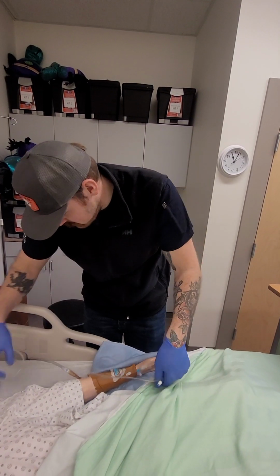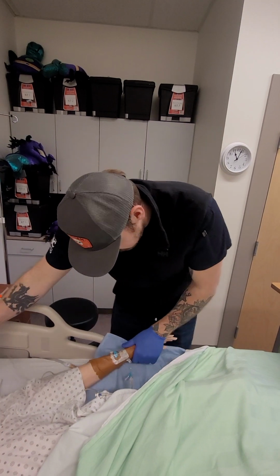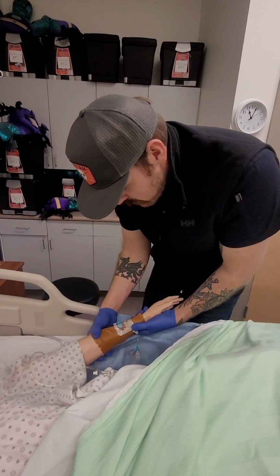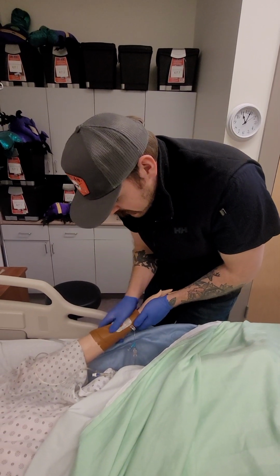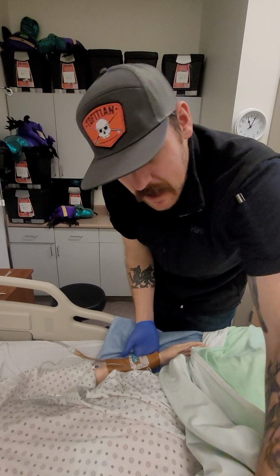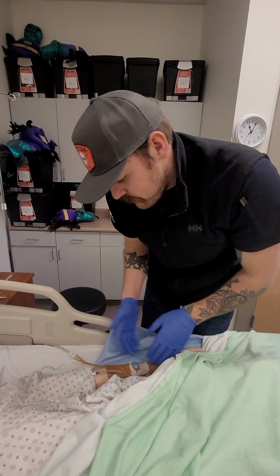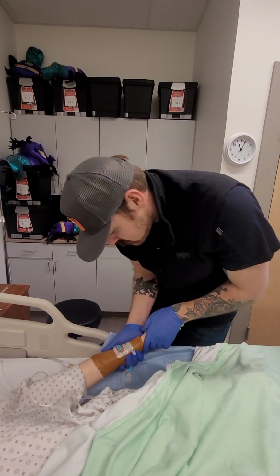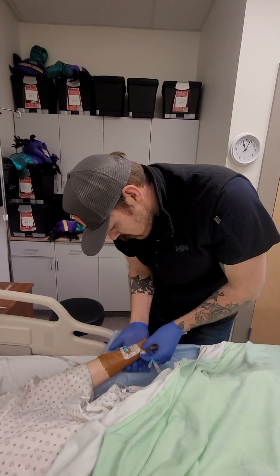So I'm going to clamp this line if it's not already done. And we're just going to take a look at our IV site. We're going to be looking for any redness, any swelling, any heat. I don't feel any. And we can also compare it with the other side just to make sure that if there was an abnormality, we would see it across. But there's no abnormality there.